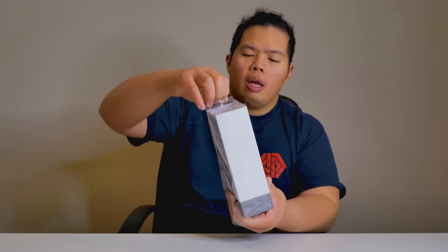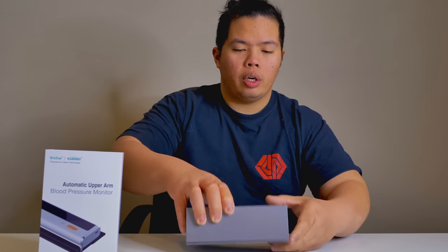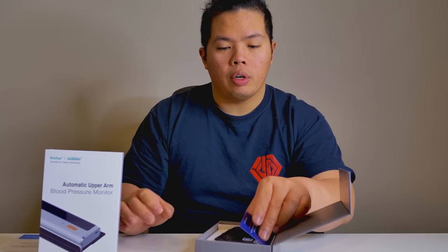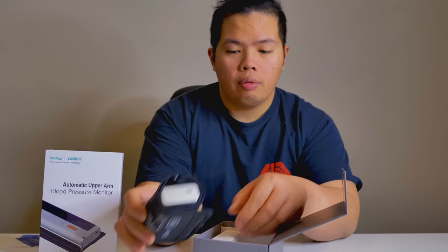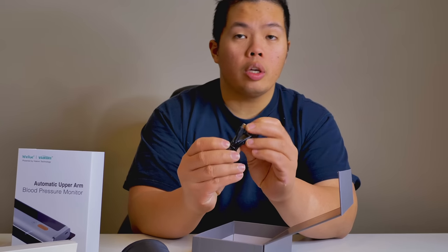This is a different type of device — I've never unboxed something like this. I'm not a doctor either, so take everything I say with a grain of salt. But today we're going to review the technology behind this. Opening up the box, we get some quick guides and user manuals. There's also a warranty card and the actual device itself. And there's a cable to charge it — USB-C as well, which is very nice.